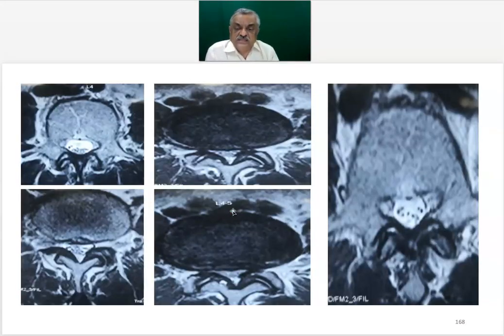Now here you will see this is the upper pedicle, we come below that, then we come further below that is the upper zone where we see clearly, then the middle zone and the lower zone. The lower zone shows this lateral recess, and you have to see this is the body of the vertebra, pedicle of the vertebra. This is SAP beginning, IAP, SAP, IAP are articulated as a facet joint. Ligamentum flavum is from midline up to here, and which may go right up to the upper pedicle from below. So this is the way we see the various zones in the MRI.